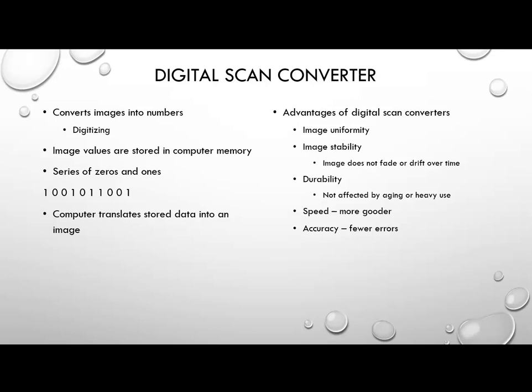Now this on an ultrasound machine is absolutely no different than the display that is done with any other computer that you may have used in your life. So every computer that we utilize uses a scan converter of some kind.